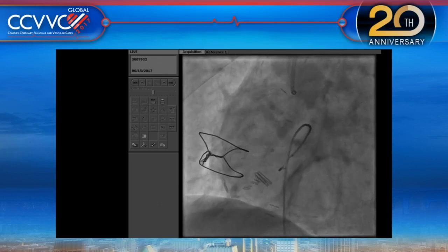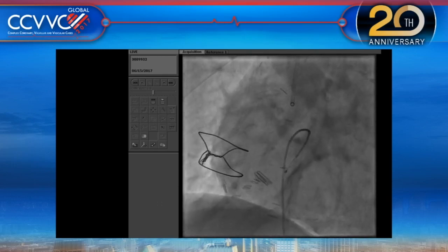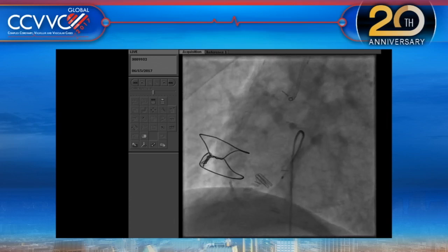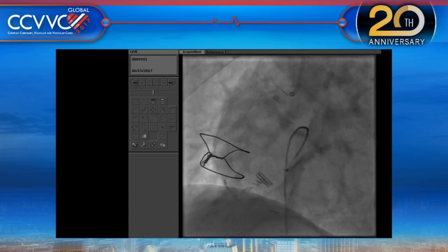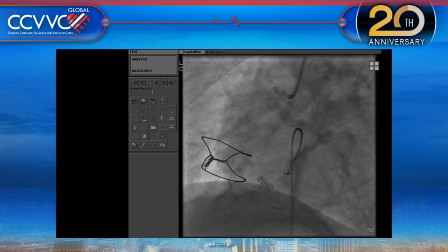And I probably will say, based on what we see now, that maybe we'll go with the 1.25 rotaburr, because at least we can do dynaglide and move the burr across. So what I would suggest, this is not a simple case. It may take another half hour.